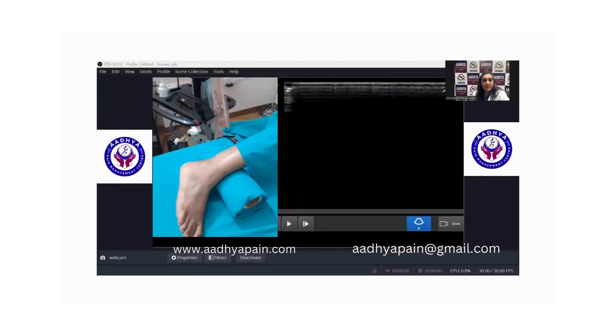Now let us see the demonstration of the ATFL. The patient is lying in the lateral position, and I have kept a rolled sheet beneath the ankle joint so that this side is lifted up for better scanning. You need a high-frequency linear probe — I am working with a frequency of 20 megahertz.